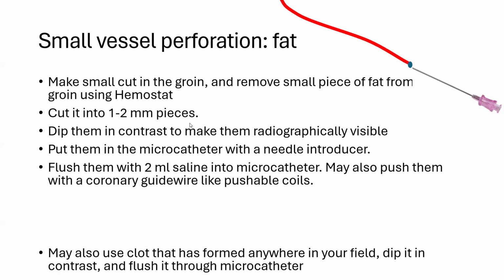Now, specifically for small vessel perforation, I mentioned fat. I will explain fat embolization briefly. The way you do it, you make a small cut in the groin and you remove a small piece of fat from the groin using a hemostat.